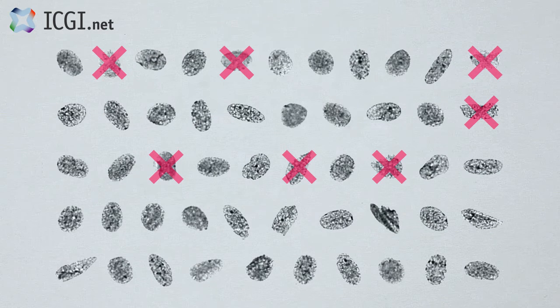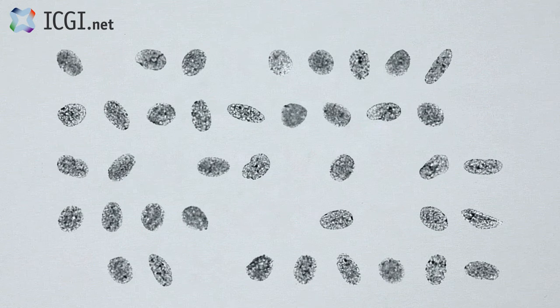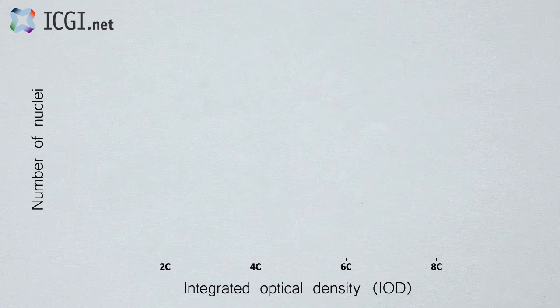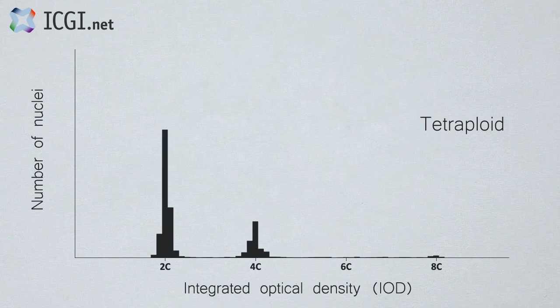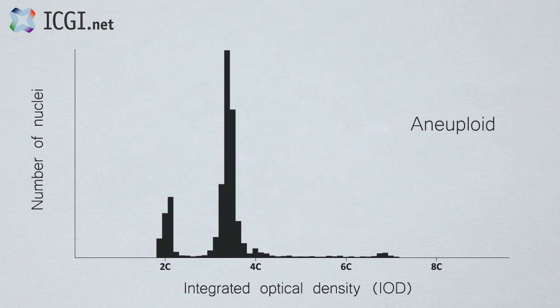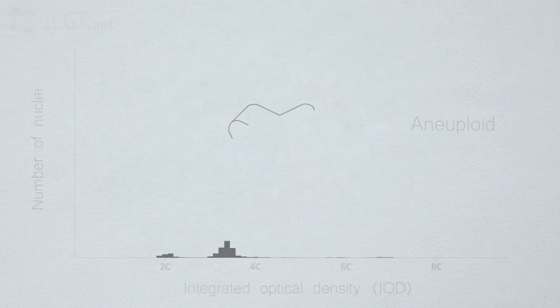PWS Classifier is used to manually verify the accuracy of the Grabber algorithms and ensure each nucleus is complete, uncut, and not overlapping. Once the dataset is determined fit, the integrated optical density, IOD, is calculated by summing up the optical density of each pixel in the nucleus. The IOD value and total nuclei count are plotted in a histogram, which is analyzed and classified into one of 4 categories: diploid, tetraploid, polyploid, or aneuploid. The attending physician is informed of the result.